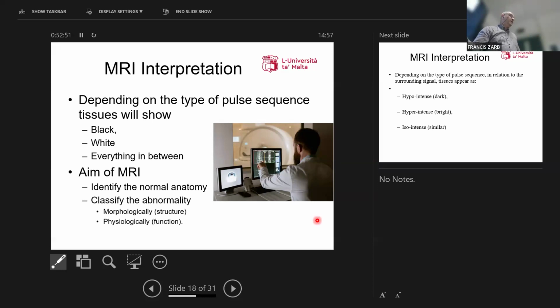Nuclear medicine. Nuclear medicine, the anatomy is limited, but the function is more. All right? Mela inti qed tara l-istruttura, il-shape, il-size, whatever. U jekk għandek patoloġija u bidlitlek il-shape jew bidlitlek il-size, hemmhekk nistgħu nidentifikaw, we can identify that there is a pathology. Okay?